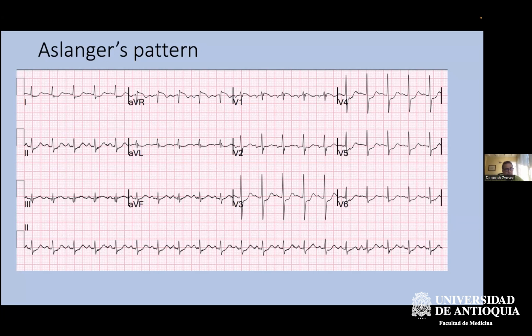Well, as I said, the American College of Cardiology now recognizes acute coronary occlusion without ST elevation as an indication for emergent cath lab activation. And they specifically mention hyperacute T waves and posterior MI, and also the Smith-modified Sgarbossa criteria for left bundle branch block and for ventricular paced rhythm. So they already recognize this in the American College of Cardiology.